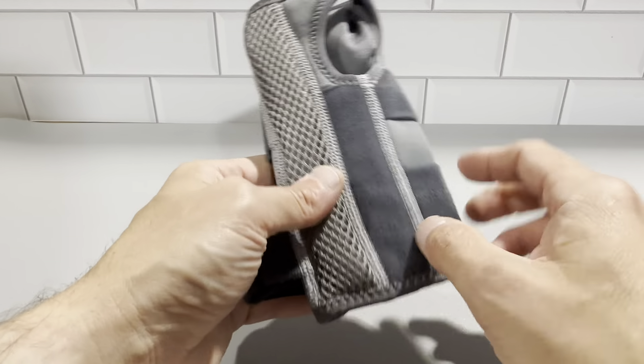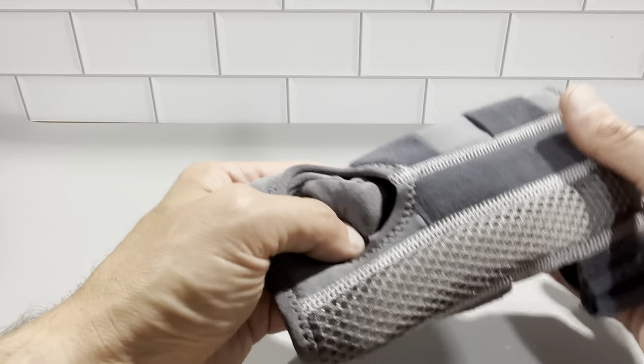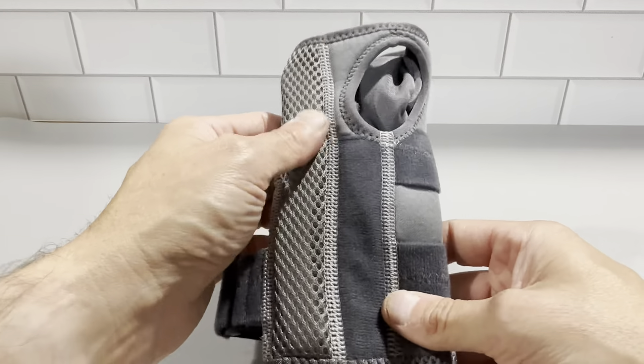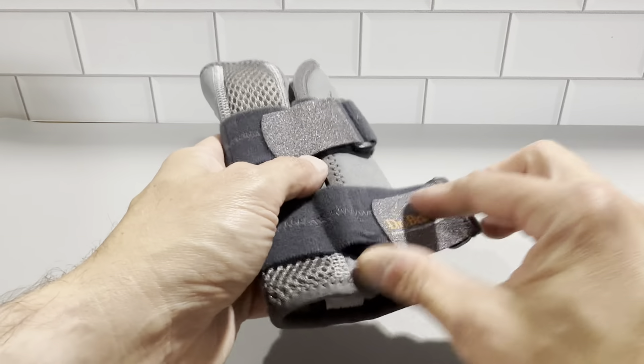To wash this brace, you're going to wash it in cold water. Don't use any fabric softener, keep it away from direct sunlight, and no bleach or ironing. You probably want to air dry this so it doesn't contract and get smaller once you're used to wearing it.